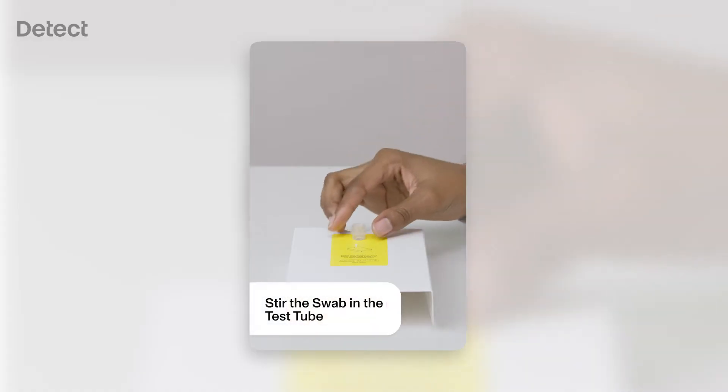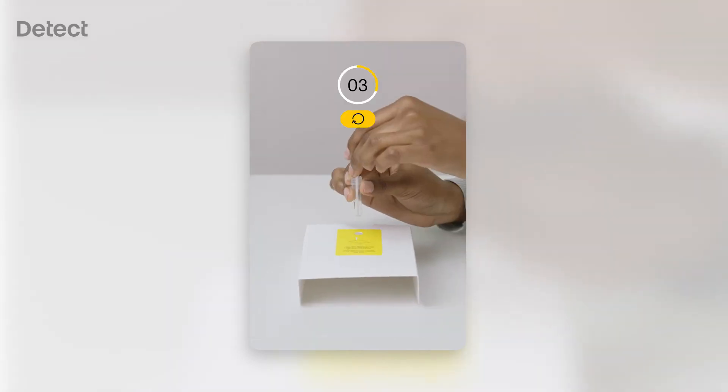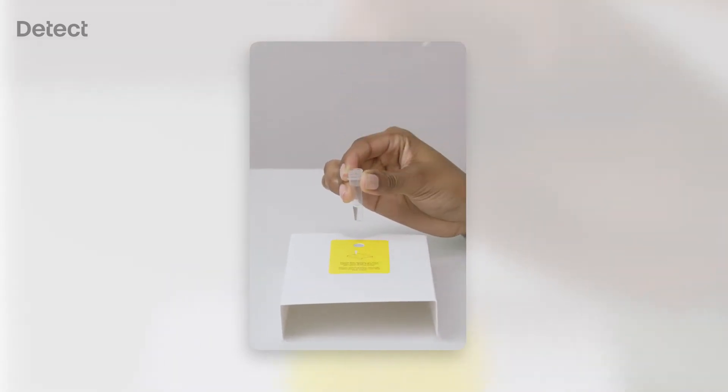Insert the swab into the test tube, making sure the soft tip is fully submerged in liquid. Hold the test tube to keep it steady and vigorously stir the swab for 15 seconds. Discard the swab when you're done.